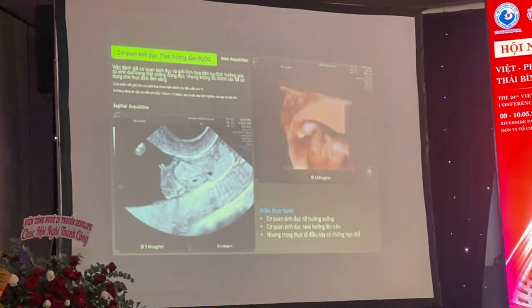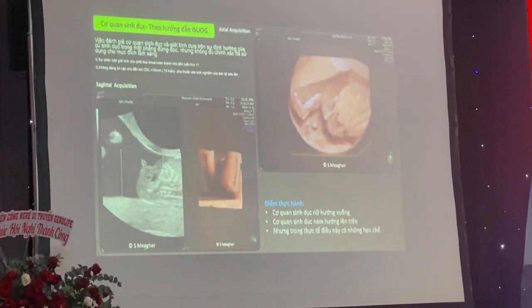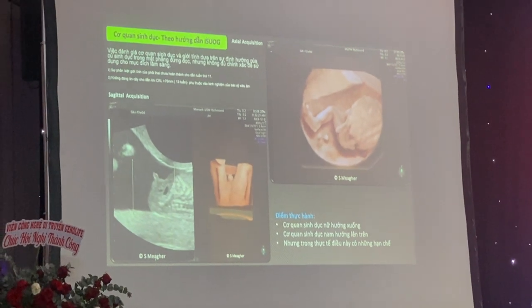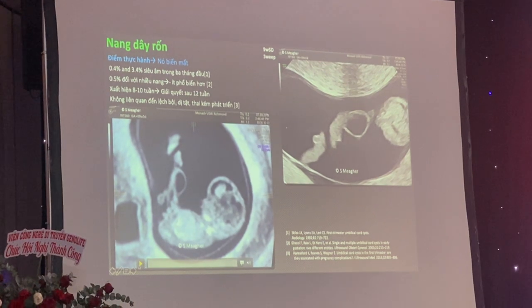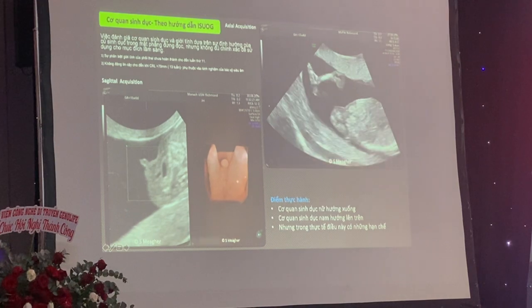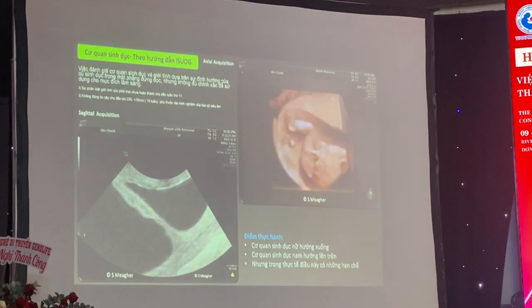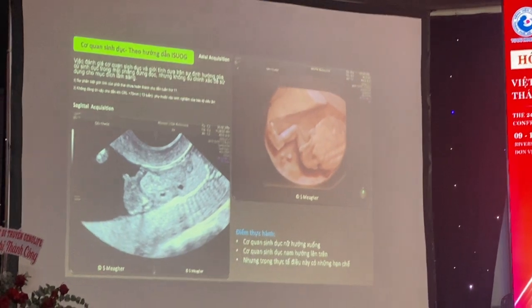And you say, Simon, why is it important to look at sex at 13 weeks? Because when the patient comes to me, I have the result of the cell-free DNA. And if the cell-free DNA says baby girl, and I do a scan and I see a baby boy, well then I've got a problem on my hands, and I need to investigate for ambiguous genitalia. That's why. And that's the advantage of having cell-free DNA at 10 weeks, is when you have a scan done, you can work out what the sex disorder is. There are other reasons, in terms of X-linked hydrocephalus and other structural abnormalities, which I like to do.